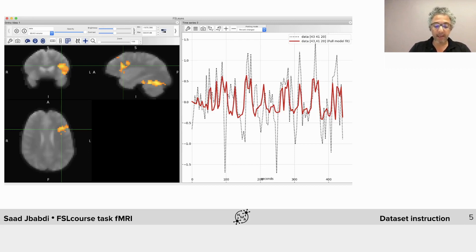On the left, you can see an example of a BOLD response of fitting data and it shows part of the brain where the BOLD response fits with our model. And on the right, you can see some actual data from a single voxel alongside a model fit in red.